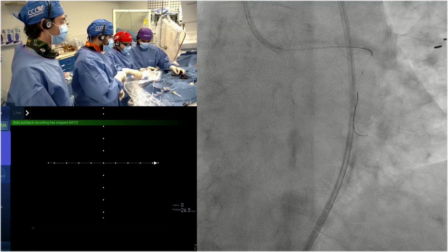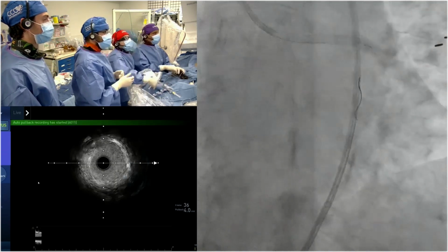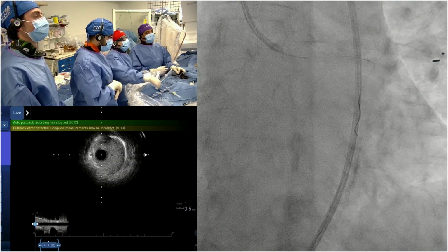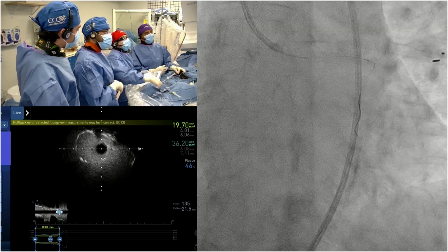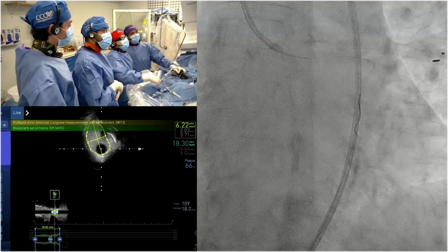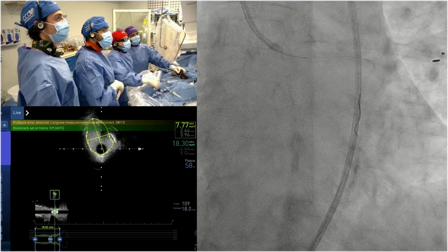Dr. Sharma, that looked very good. Okay, tell us now, I'd like to know if you had a drug-coated balloon, would you just do a drug-coated balloon and come out and not give her a stent? Looks really good on IVUS. In the large vessel? No. In the left main? I mean, I know some data for the large vessels are there. But this is what people are talking about, and I think we need trials, absolutely.